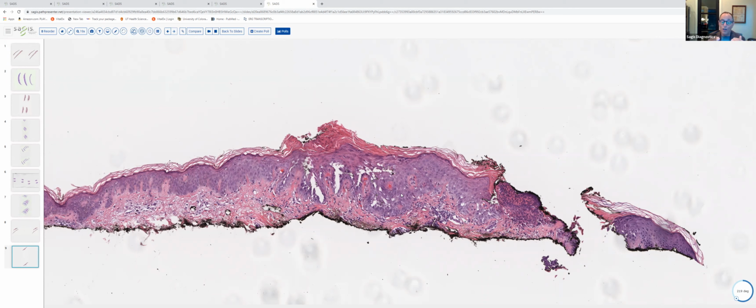But I wanted to contrast this with the acantholytic AK, and again, with the squamous cell carcinoma and with an actinic keratosis. The way you distinguish those from primary acantholytic disorders rather than neoplasms is the presence of significant cytologic atypia.